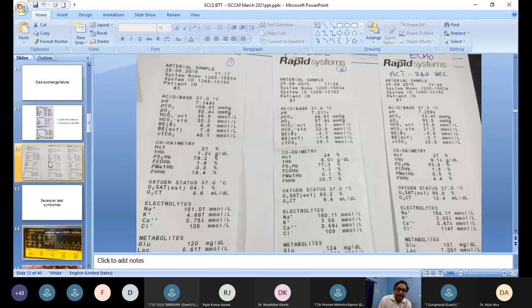And when there is a significant right ventricular failure, as I pointed out, some of these patients may require VA ECMO. So usually the escalation would be you go on to a VV ECMO. I will illustrate one of the patients we have, but just very quickly, I think this has already been dealt with. So these are the least invasive, and you can ambulate these patients.